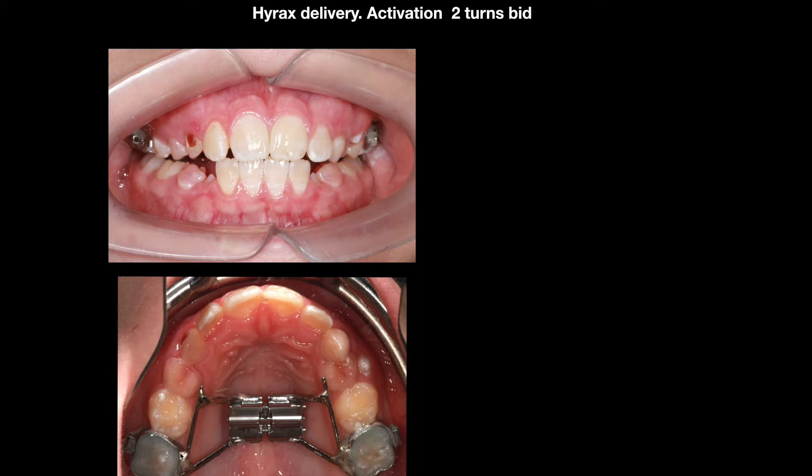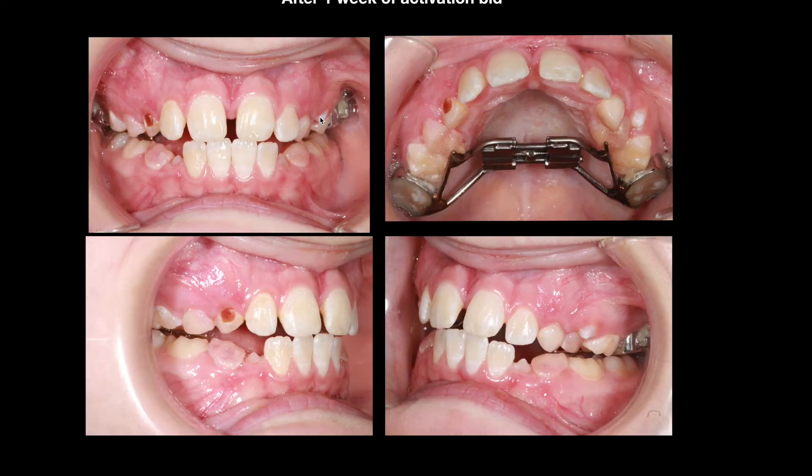As you can see, this is with the bands on the first molars, not touching any of the baby molars because they're ready to be replaced by the permanent teeth. We see that the screw is still unopened. We instructed the patient to do two turns a day — as previously described in one of my earlier videos — two activation turns in the morning and two in the evening, with an initial two to three turns during the initial visit.